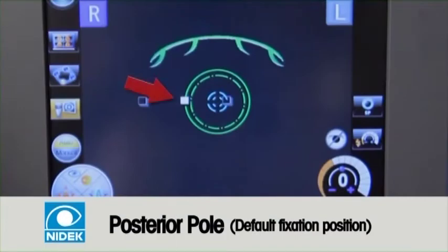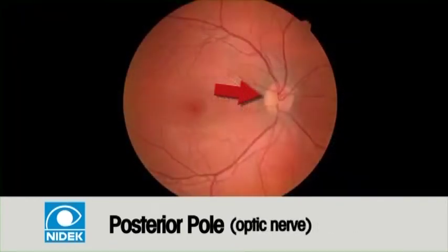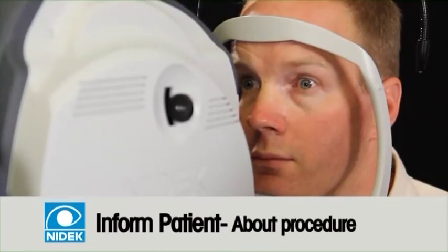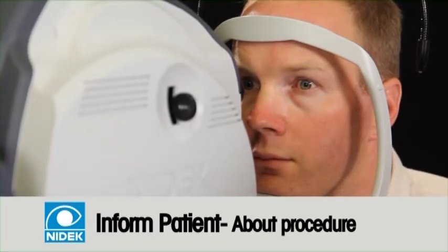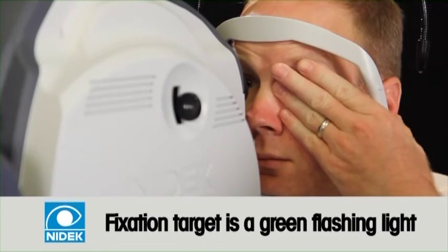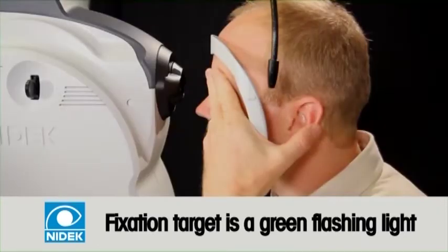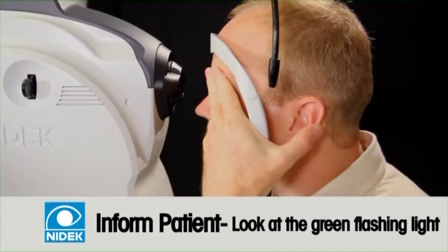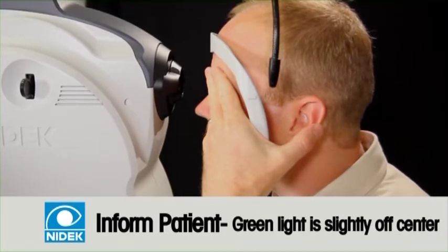Fundus images are captured at the default fixation target position, which is the posterior pole. The posterior pole includes both the optic nerve and the macula. Before taking the image, it is important to inform the patient what they are going to expect during the test. Instruct the patient they will see a green blinking target appearing as the camera comes closer to them. It will appear to be doubled and off-center. Reassure the patient this is normal and to continue to look at the fixation target.